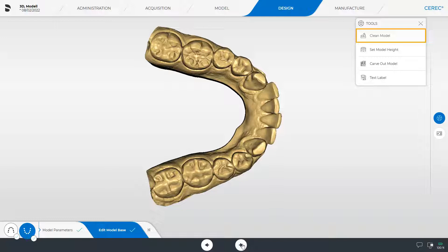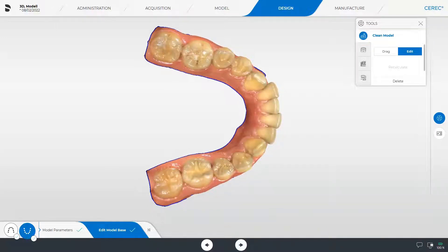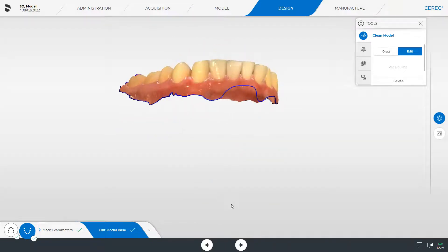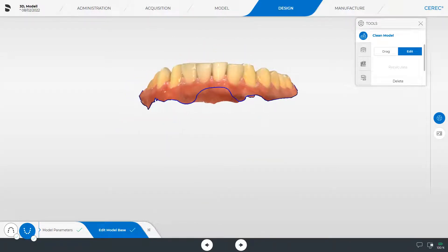We start with the clean model option. After enabling this tool, the model is displayed in color and outlined in blue. This line can be edited or dragged. We make an adjustment in one place: starting on the line with a double click, placing further single clicks as needed, and finishing the correction with a double click.